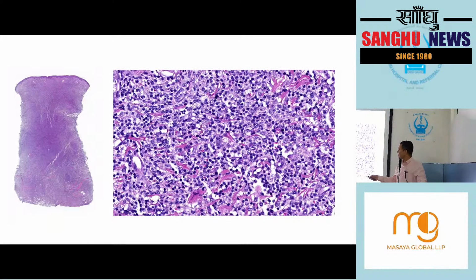This is what I received, everything, a punch biopsy. See, everything blue, top to bottom. You see the epidermis, a thin epidermis, you can see it here. Everything top to bottom is blue. Subcutis involved. Everything blue. Everything lymphoid. This is what I received, the whole punch biopsy.